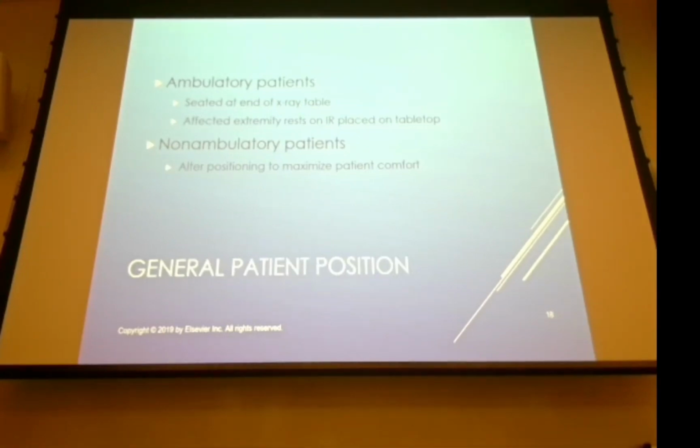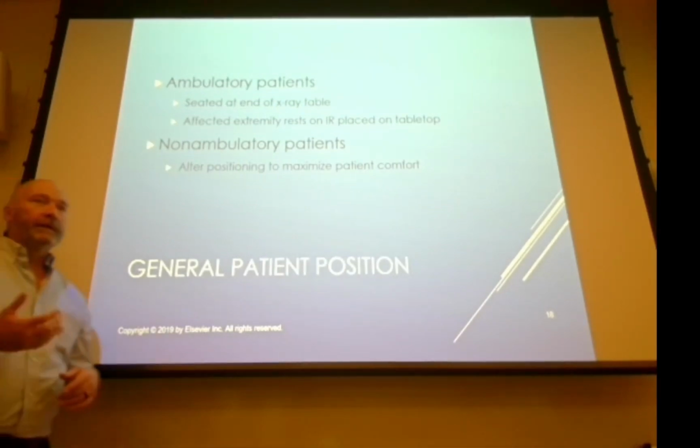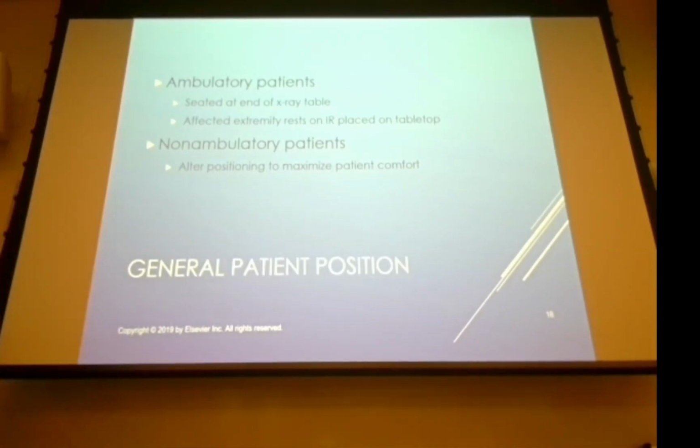Artifacts, ambulatory patients. So if you're doing an exam on a patient, let's say an ER patient, and they're on a stretcher, my recommendation is to move the patient as little as possible. If you're doing fingers on an ER patient on a stretcher, is there really any reason to get them off of that stretcher, put them onto the x-ray table and position them on the x-ray table? And the answer is no, there's not really. Make it easy on the patient. Just do the exam on the stretcher.